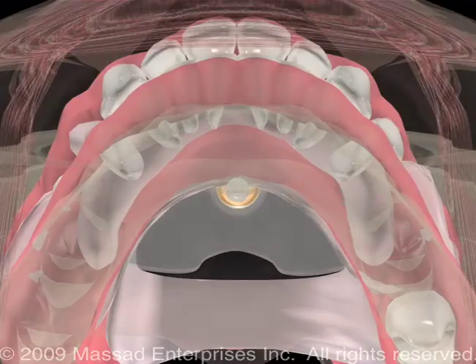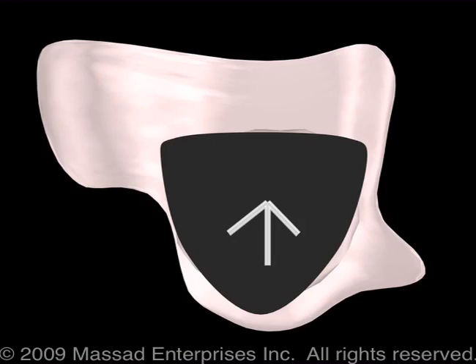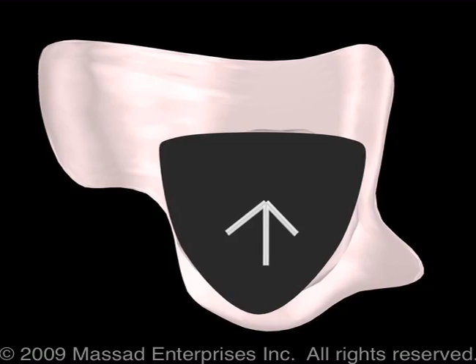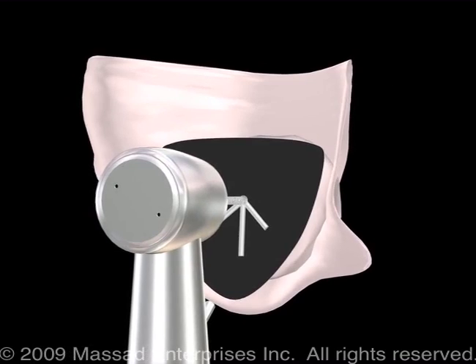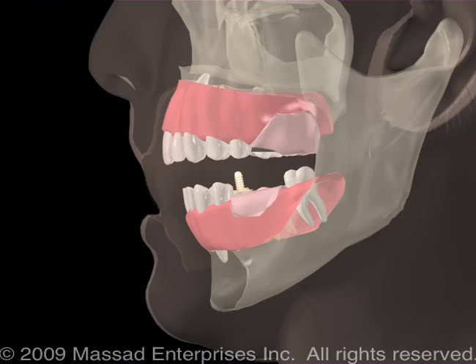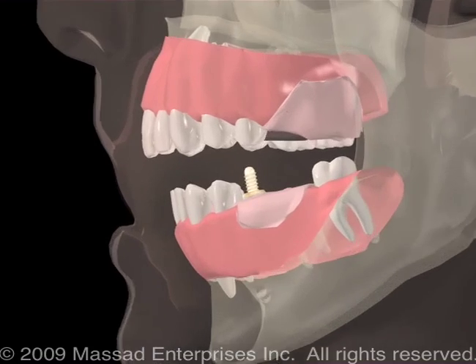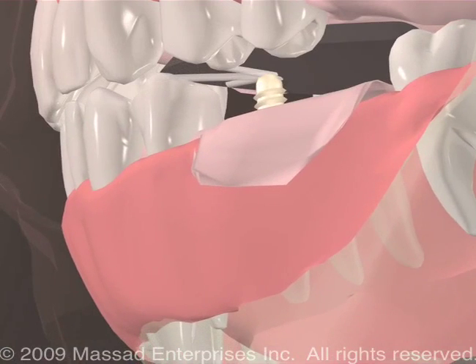Once this is completed, it will then be necessary to analyze the recording. As seen here, the patient has produced an appropriate arrow. At the apex of the arrow, some practitioners would like to make a small hole or dimple in the striking plate in order to have the patient be secure at the apex. Either cutting a small hole or dimple can be done or use the plastic receiving device.